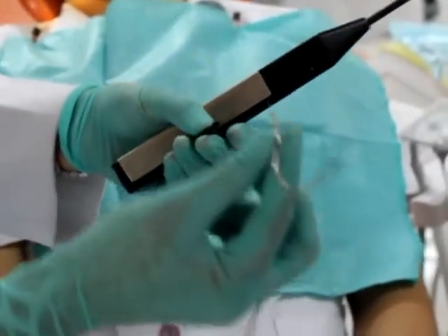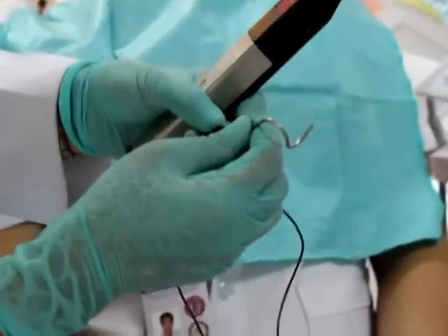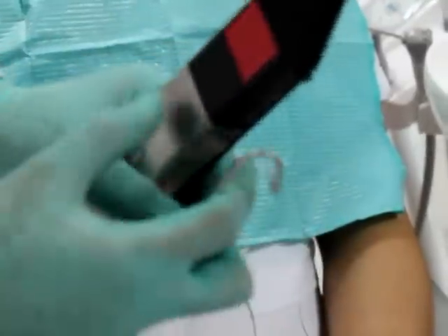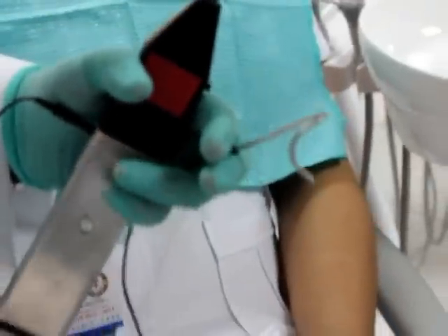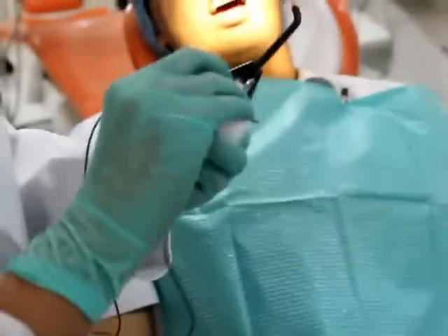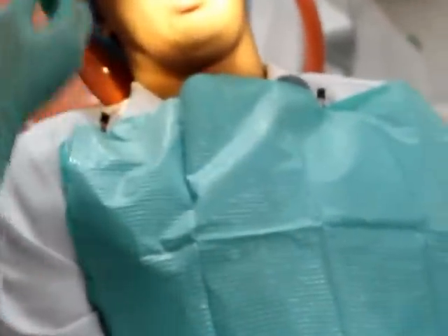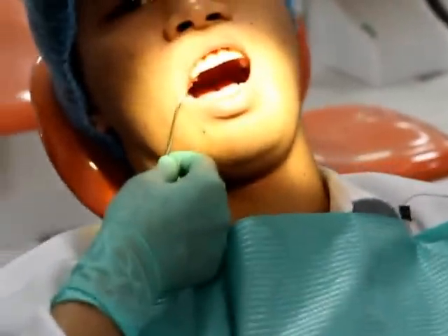So number 1, the lip clip should be inserted, and then the other end should be placed here. And then get alcohol, soak this with alcohol and clean. Then put it on the patient's lip.